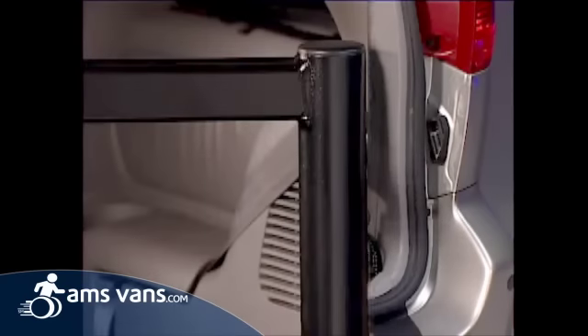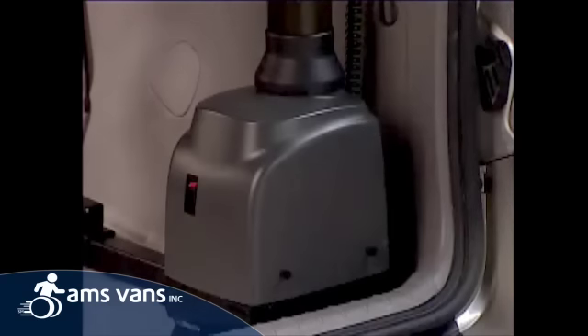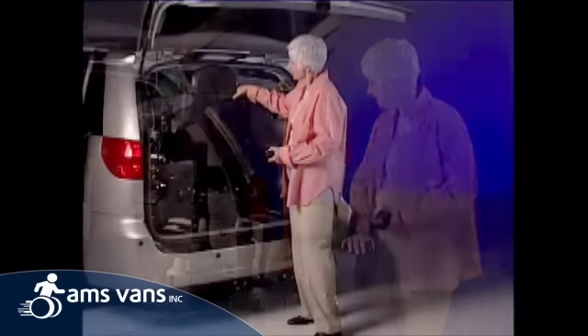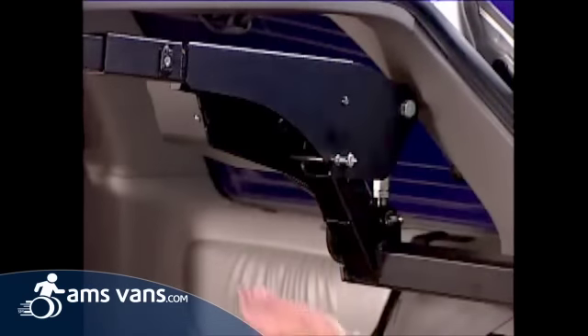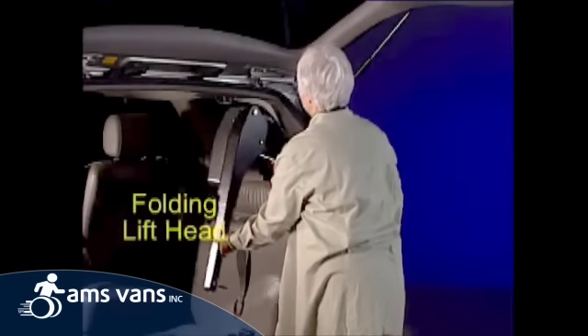With scratch-resistant textured black finish on all visible metal and attractive automotive-style color-keyed shrouding on the motors, the Curbsider's elegant and refined design blends into the vehicle's interior, occupying an amazingly small area. And when a mobility device is not in the vehicle, the Curbsider's lift head folds down, improving driver visibility.